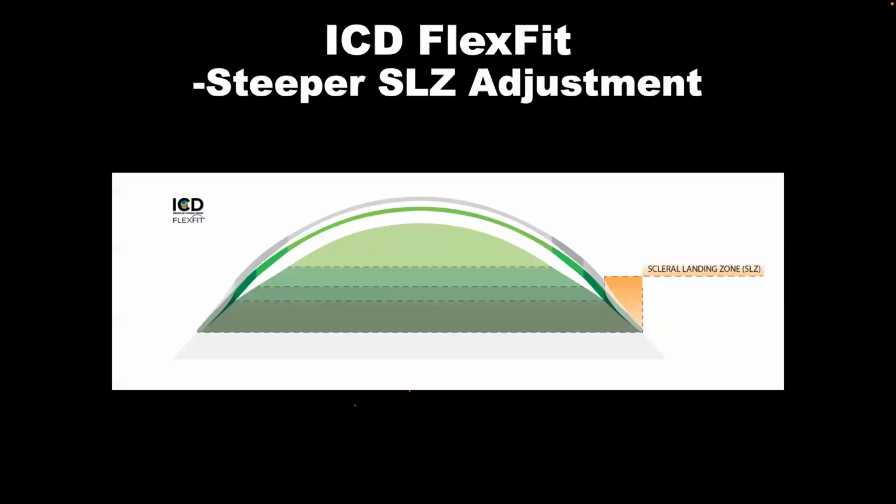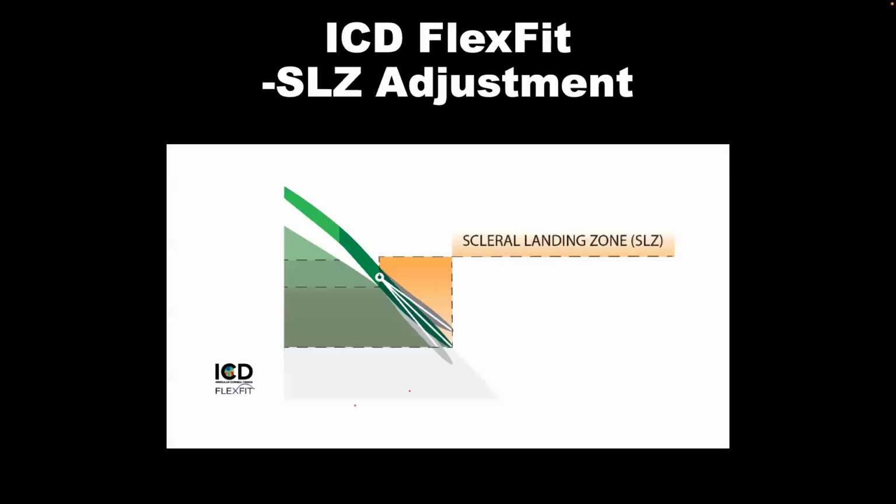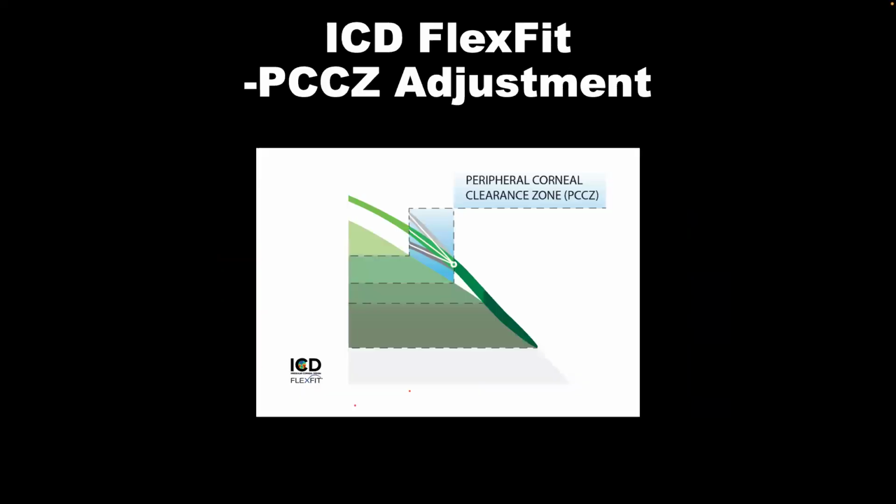with the other zones. So for instance, and I will go back a little bit here. If I'm changing the scleral landing zone of -25, my best suggestion to you would be go to the peripheral corneal zone and just change and steepen that 25 microns that you're losing. And the thing is just to try to maintain the same central apical clearance and not alter it.